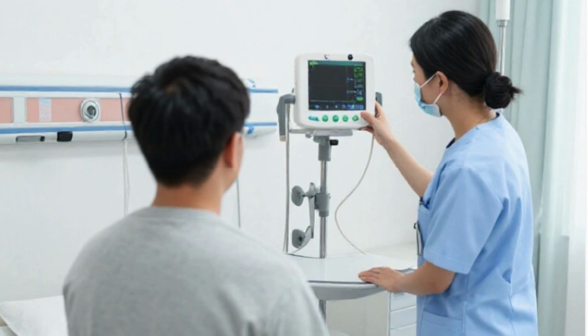A typical system consists of sensors, cables, a processing unit, a display, alarms, and a power supply. Each component has a specific function, and all components must work together accurately to ensure reliable monitoring. The sensors are responsible for detecting physiological signals from the patient. For example, ECG electrodes detect the electrical activity of the heart, a pulse oximeter sensor measures oxygen saturation, and a blood pressure cuff measures arterial pressure. Proper sensor placement is essential, as incorrect placement can lead to inaccurate readings or false alarms.